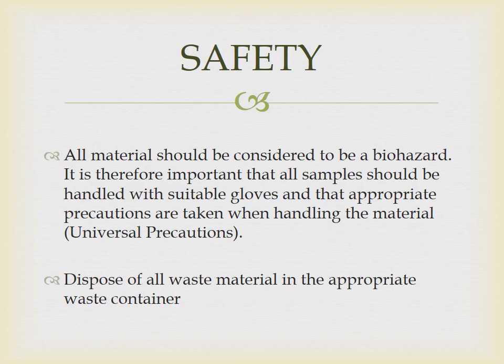For safety, all material should be considered to be a biohazard. It is therefore important that all samples should be handled with suitable gloves, and that appropriate precautions are taken when handling the material using universal precautions. Dispose of all waste material in the appropriate waste container.